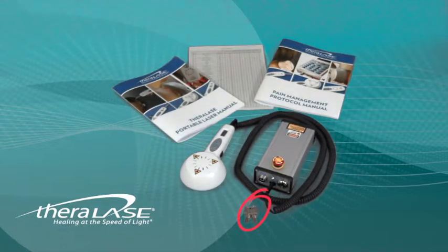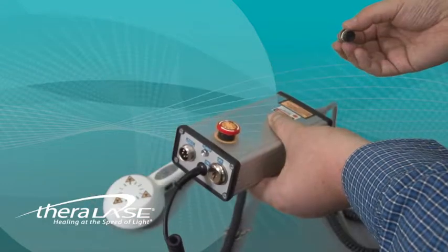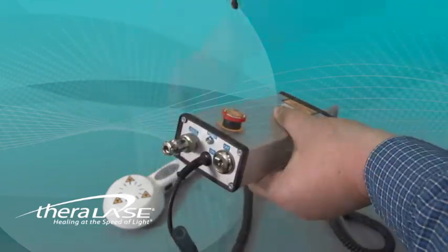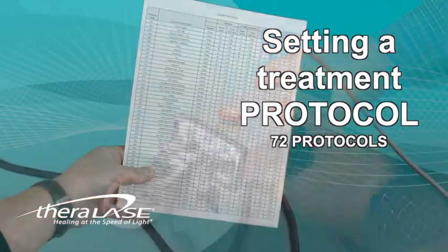A set of duplicate keys, as well as the remote interlock connector, are required in order to be able to safely arm the TLC-900. The hospital-grade electrical cord connects the TLC-900 power supply to the closest available electrical outlet. This is how to go about installing the remote interlock connector and key if you have not already done so. Now we are ready to set the protocol.